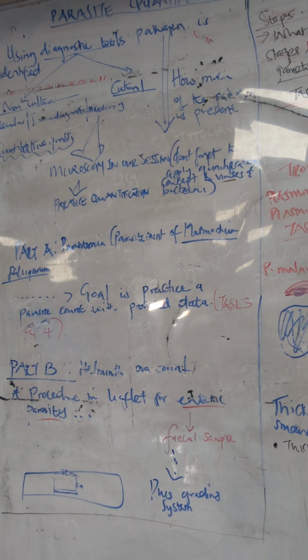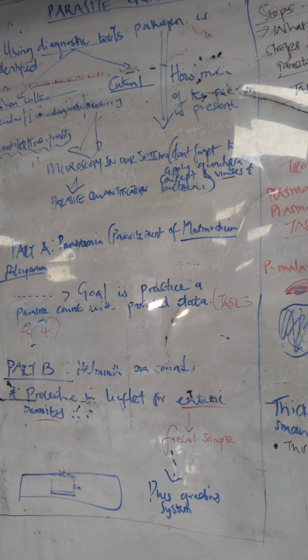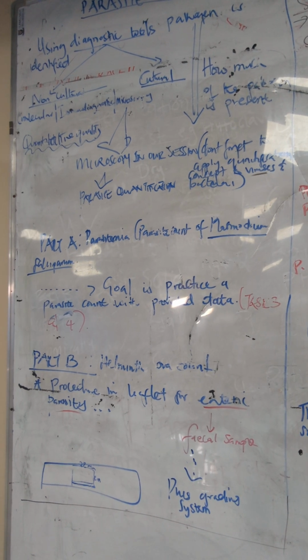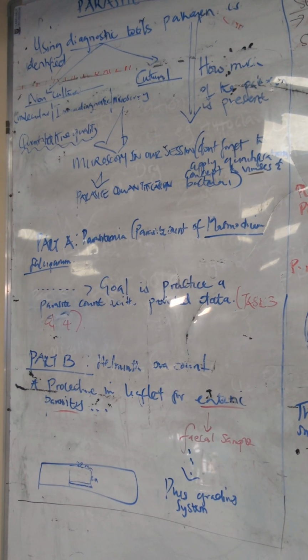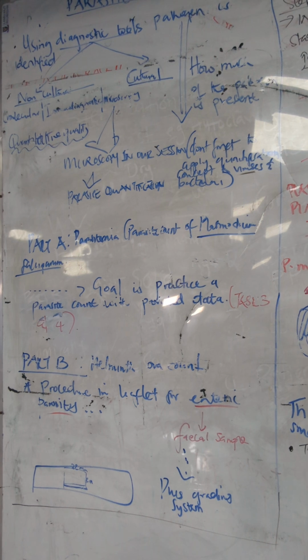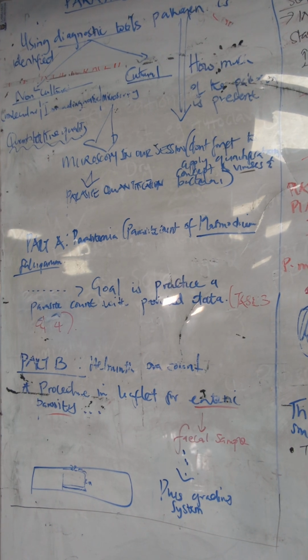You actually had to do some microscopy and a practice at the end of part A. But part B, the helminth egg count, is basically just a run through of a standard procedure that you'll come across when you see a report about an enteric parasite and it was graded. So that was just briefly a mention of part B.